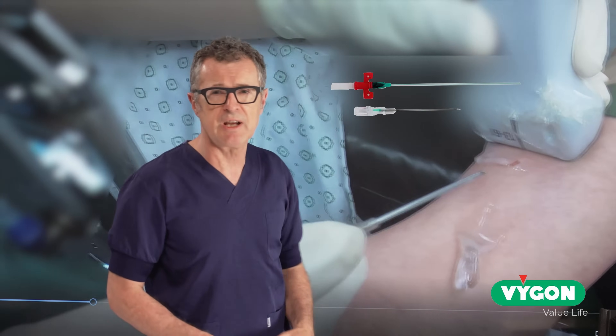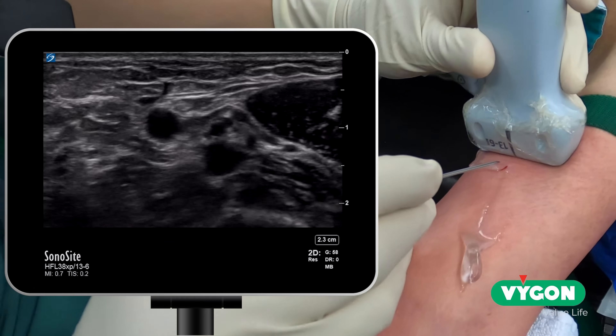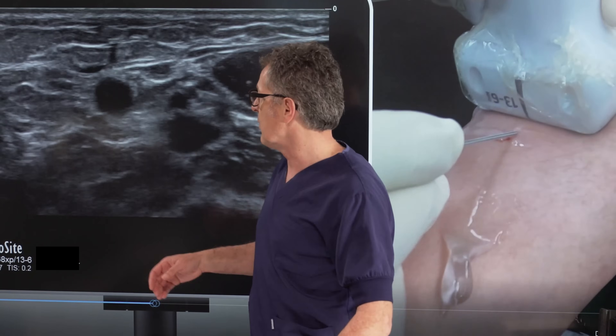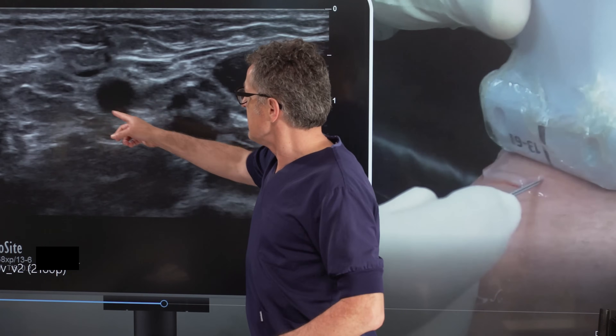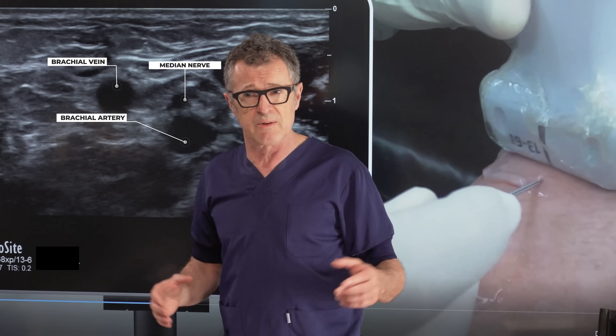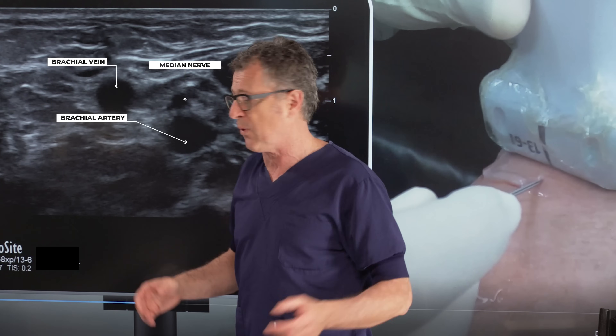We're going to insert the needle through the anesthetized skin, which makes the procedure much more pleasant for the patient. Now, this is important — what we really want to see is: this is the brachial vein, this is the brachial artery, and here is also the median nerve, so you really have to be careful.